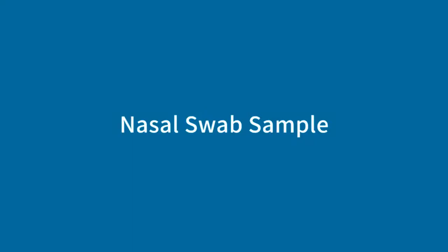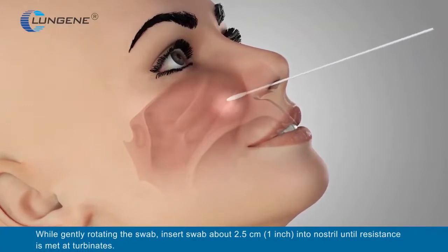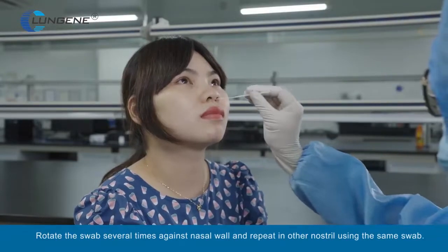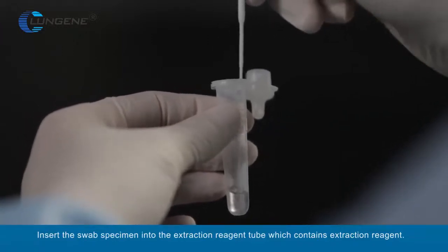Nasal swab sample. While gently rotating the swab, insert swab about 2.5 centimeters (1 inch) into nostril until resistance is met at turbinates. Rotate the swab several times against the nasal wall and repeat in other nostril using the same swab. Insert the swab specimen into the extraction tube, which contains extraction reagent.